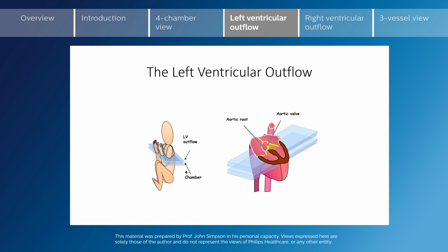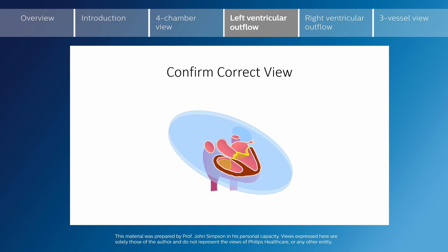As we sweep up towards the left ventricular outflow tract, we are sweeping superiorly from the four-chamber view. This is done to bring in the left ventricular outflow tract. We can see in the diagram the aortic valve and the aortic root, which lie above the plane of the four-chamber view shown by the blue planes below. We need to confirm the correct view by seeing the aorta as it leaves the left ventricle, making a very slight angulation upwards and slightly obliquely to bring in this view.